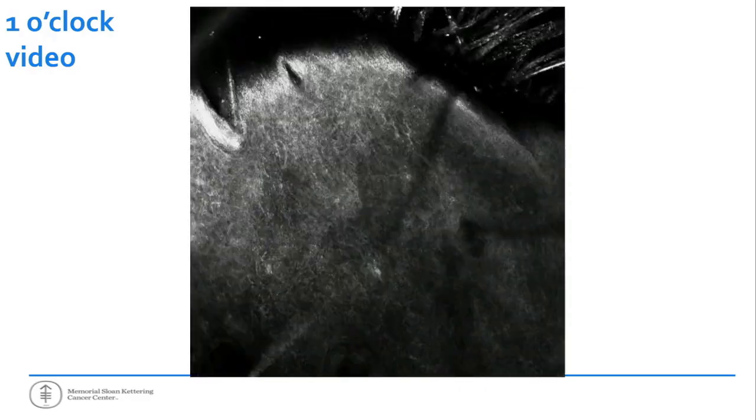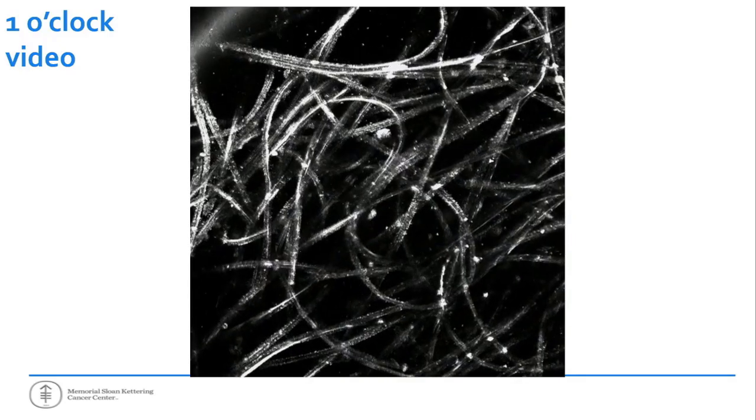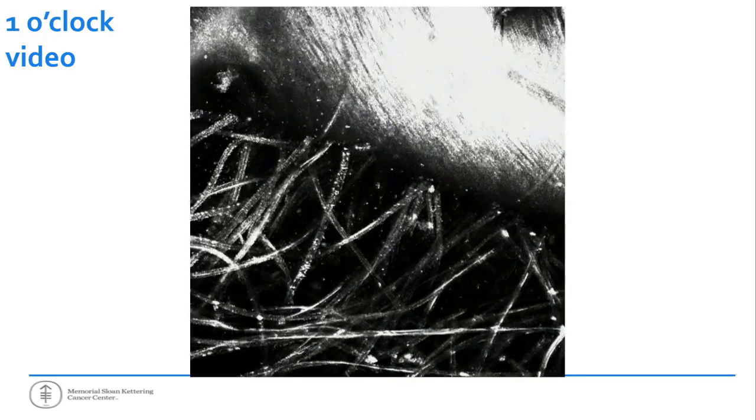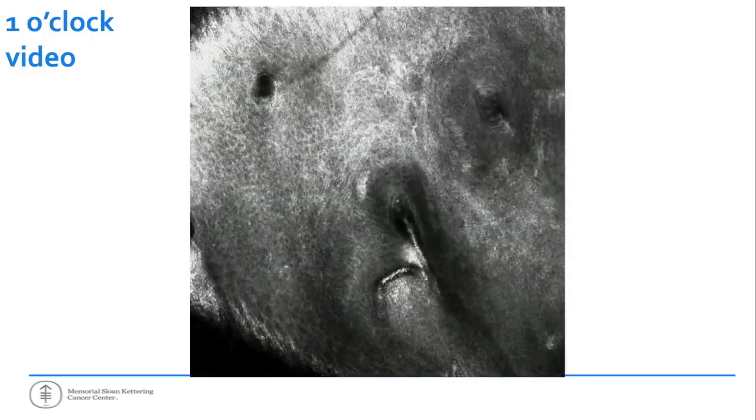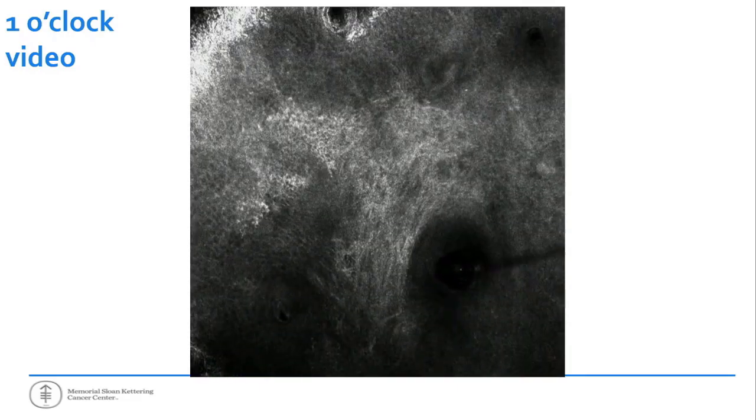Yeah, so then we can create sort of videos. That's the paper ring that you see there. So that's our boundary. We're crossing over it. And now we're outside the paper ring. We come back into focus. Again, hair follicle. You can still see some aspects of these dendritic cells, right? That's still considered a positive margin for us. We keep going.